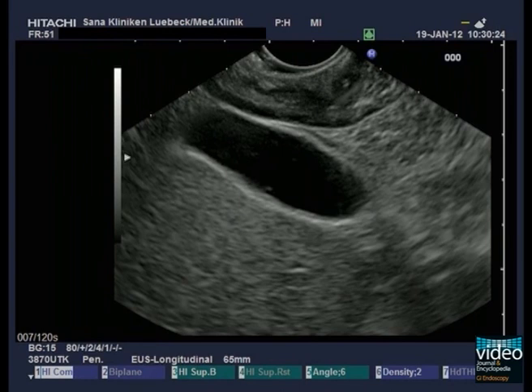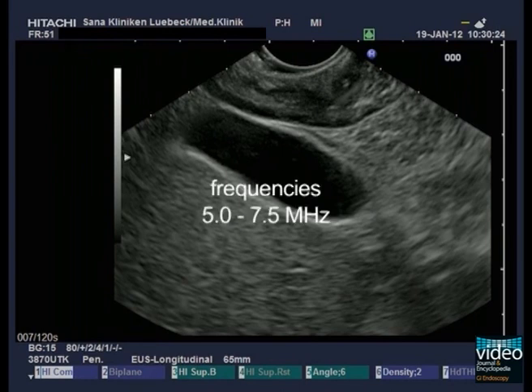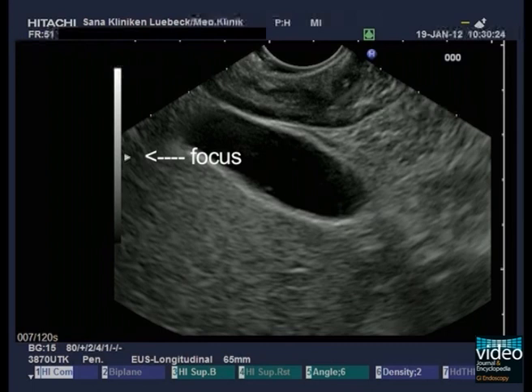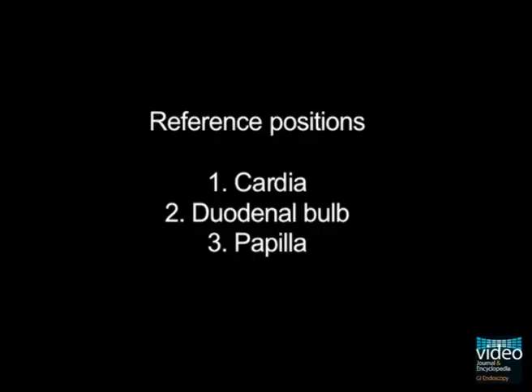For the demonstration of the guiding structures, ultrasound frequencies between 5.0 and 7.5 MHz are recommended. The focus of the ultrasound machine should always be placed at the point of interest. In the upper abdomen, you have three important reference positions to identify the anatomical guiding structures: first, the cardia; second, the duodenal bulb; and third, the level of the papilla.